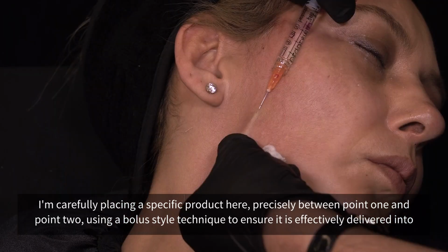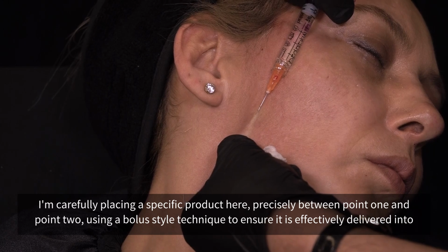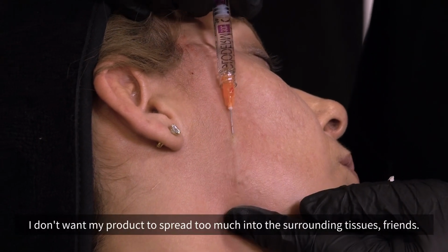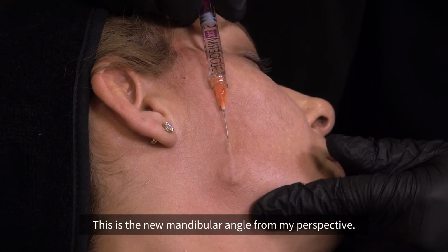I'm carefully placing a specific product here, precisely between point 1 and point 2, using a bolus-style technique to ensure it is effectively delivered into the skin. I'm also checking it with my finger. I don't want my product to spread too much into the surrounding tissues, friends. This is the new mandibular angle from my perspective.